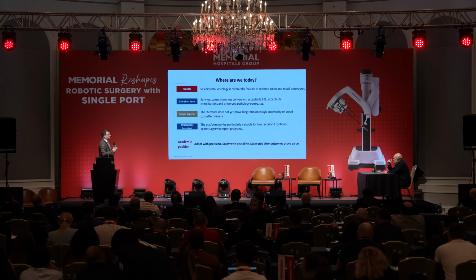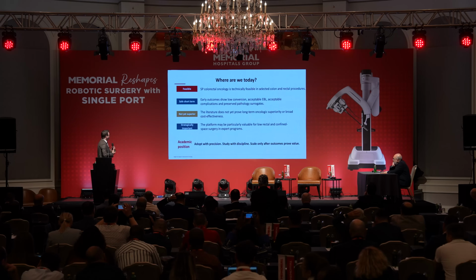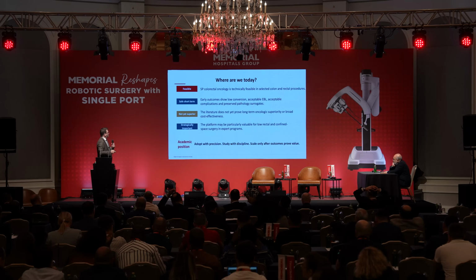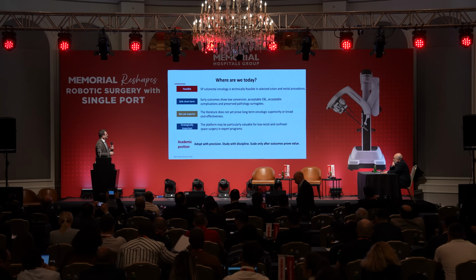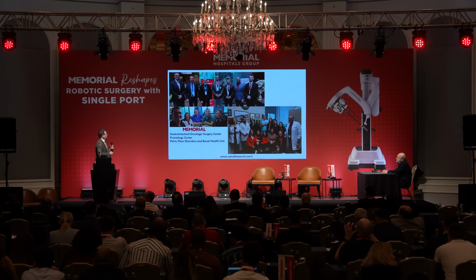So it is a safe and feasible procedure. We have the short-term results in the field of general surgery. It's not oncologically superior yet to the existing multiport technology, but with adoption of precision, with discipline, and evaluating the outcomes regularly, I think we will reach it to a certain degree.